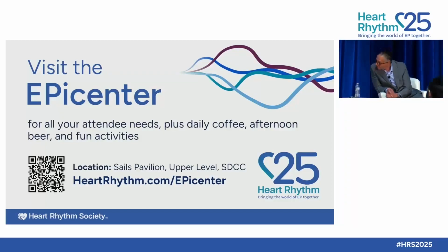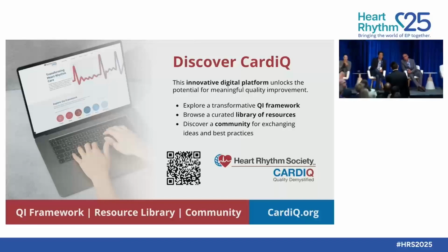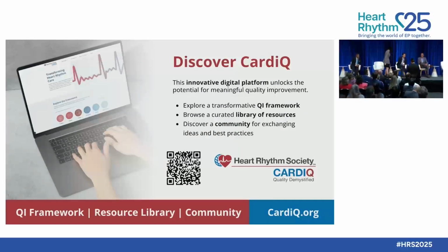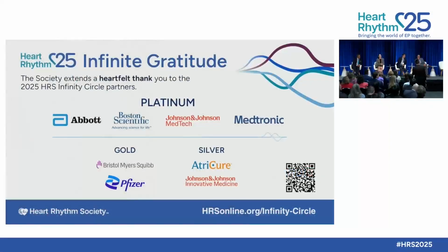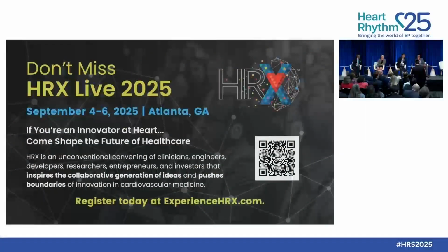Okay, great. I think we have about 20 minutes for questions and answers. Yes. In both examples you gave, they both had anterior mitral lines added. If you look at the tailored AF data, the majority of the dispersion signals that they picked up were in the anterior wall. So if I just didn't buy Volta and instead took a pulse field catheter and did a great job homogenizing the anterior wall, doing a great line, I would have essentially gotten to the same conclusion you both did, probably faster. I wouldn't have had to do all the intense mapping and had the same result.